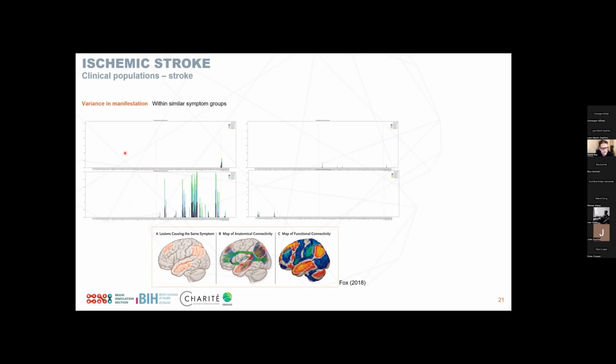We have on the left here, left hemisphere, right hemisphere, and then subcortical areas. That varies significantly. Here we have some left area, here we have some right hemisphere, we have subcortical areas. And then from black to blue to green to yellow represents the 4 time points, so that we see over time a lot of the black, a lot of these areas actually disappear. And we have different areas coming up because we have, as we've seen on the slide before, this dynamic over time of the lesions. So we have now specific regions that are not actually affected anymore after some recovery of the lesion manifestation.